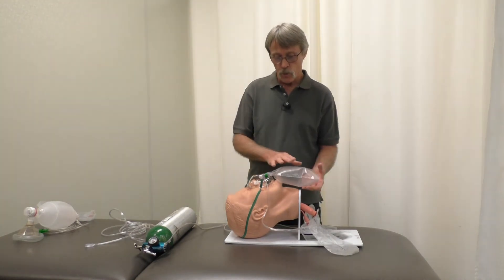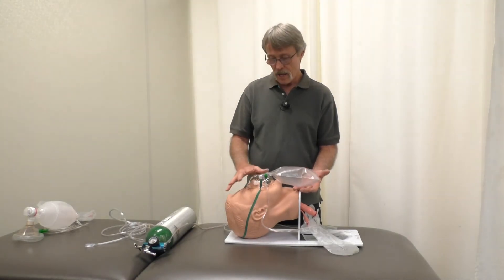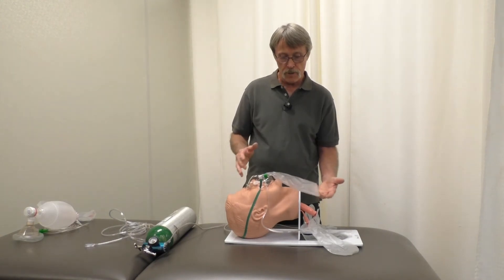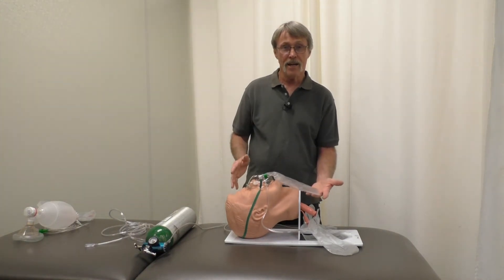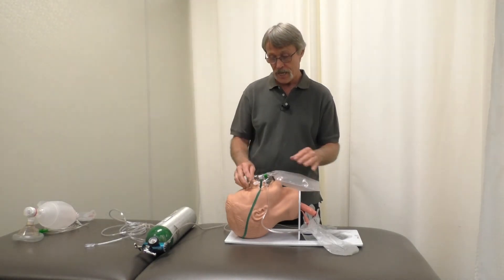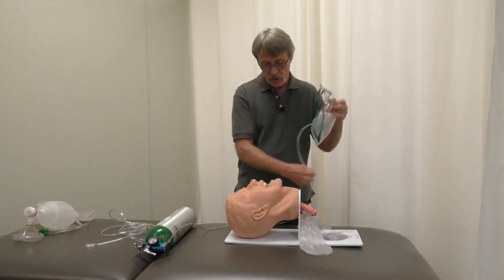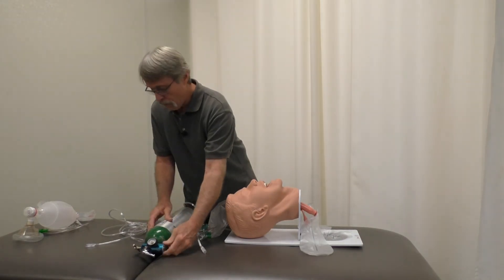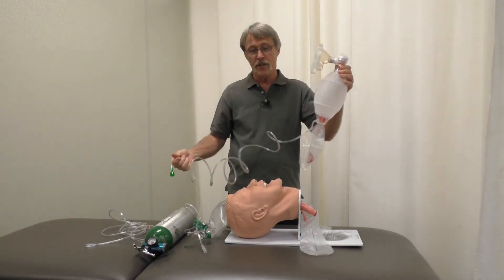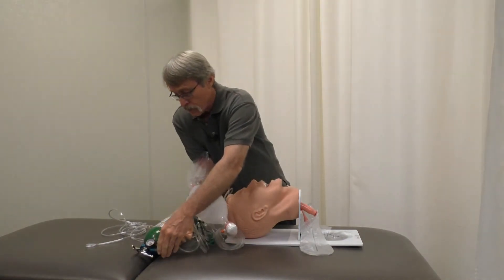Make sure the patient is not in respiratory distress. If every time they take a breath the bag collapses completely, that means they're breathing harder than the flow can support. In that case, remove the non-rebreather and get the BVM ready to breathe for them. The BVM — same thing — hook it on to the regulator.